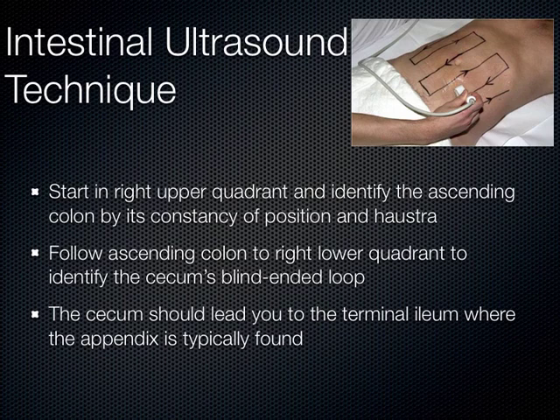That's kind of how we quickly can decide between small bowel and large bowel on any imaging study, looking at haustra versus plicae circularis. That sounds like it's minutia, but actually that comes into play quite a bit in most fields, so something you might want to remember. You're going to follow that ascending colon.